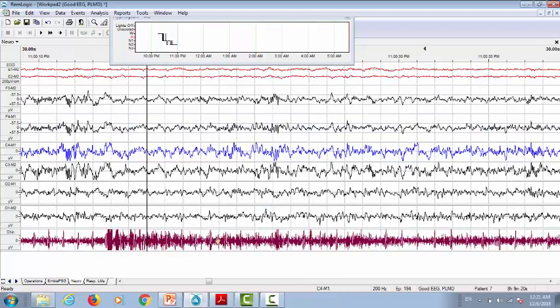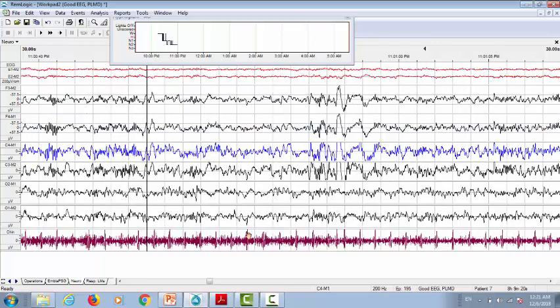Another increase in chin EMG tone. So we continue as N2. We score this as N2, but also if you look at the end portion, we started to have low tone. So we pay attention to that for the next epoch.